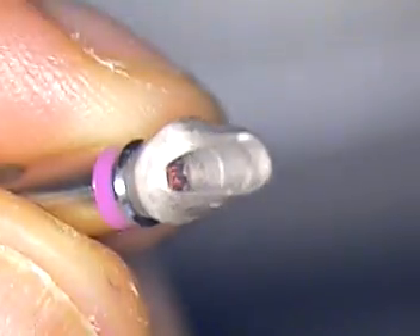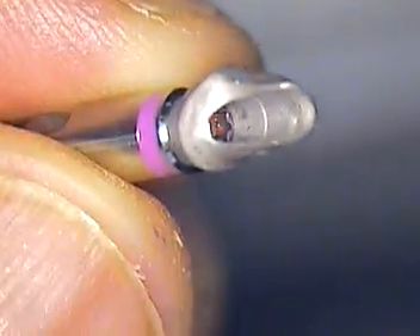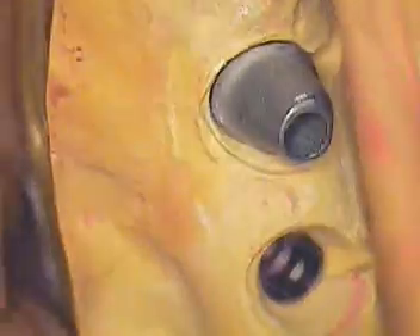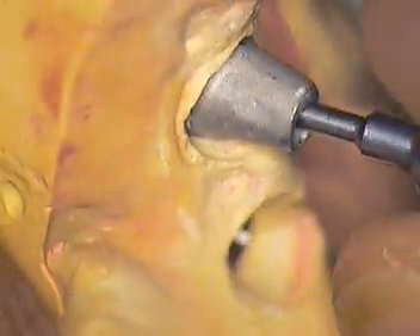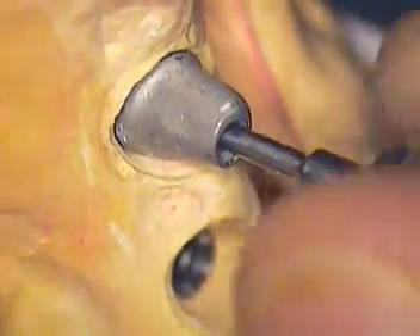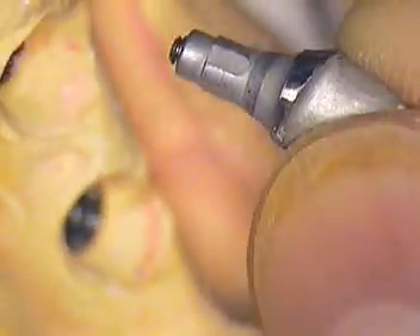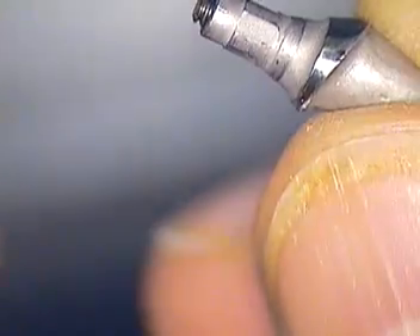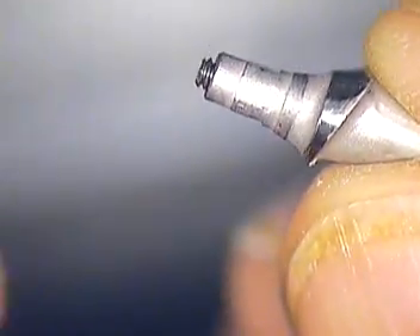I'll show you the other abutment. It's good to have an extra analog so you can do these try-ins at chairside, in your buffer zone, or in your own small lab. Utilizing a microscope really makes the job very easy to see. So here's the other abutment — this area subgingivally and right in the embrasure space should be highly polished. It is not.